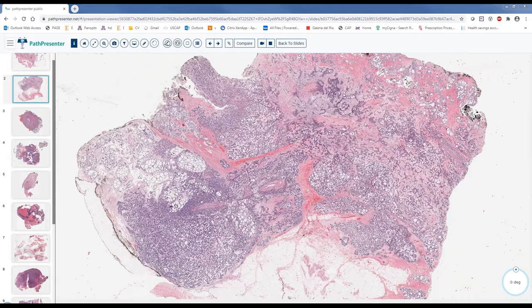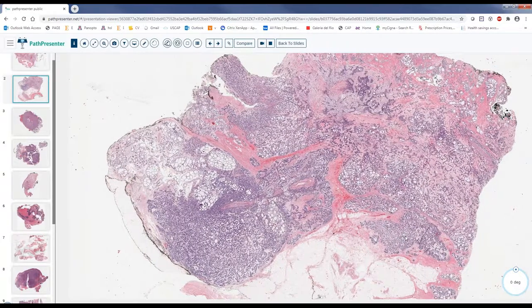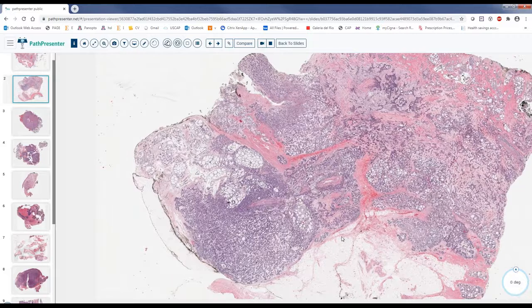Yeah, excellent. I see most of you got it. Good. This is adenoid cystic carcinoma. Again, these are the things that you look into and you know them. All right. So adenoid cystic carcinoma. There are also some important things that you have to put in your diagnosis, and they will ask for it. First of all, they will ask you the grade. Okay, so grading is very important. They will ask you the margin. Okay, and obviously here, the ink margin is positive. And they will ask you about perineural invasion.